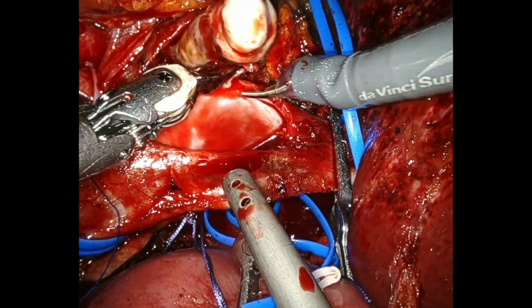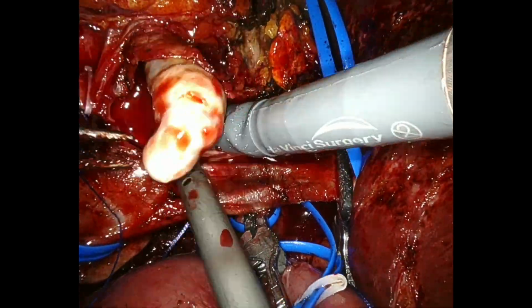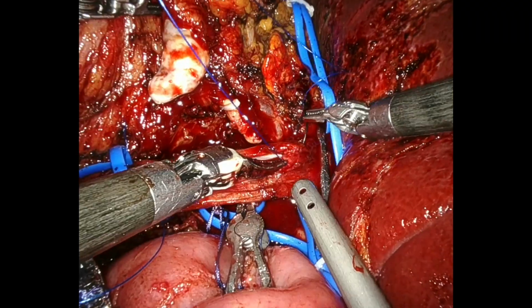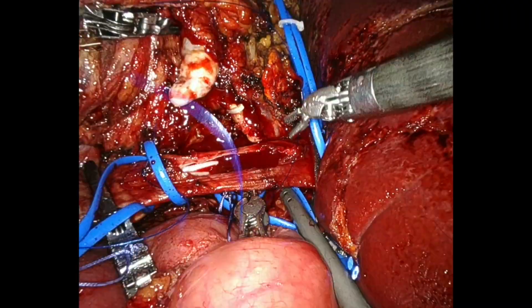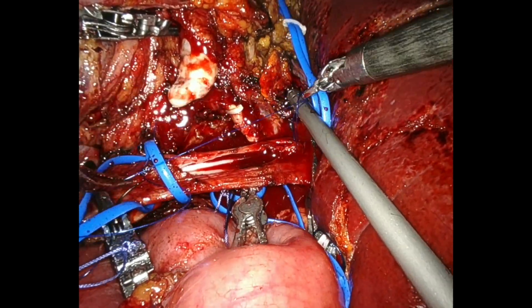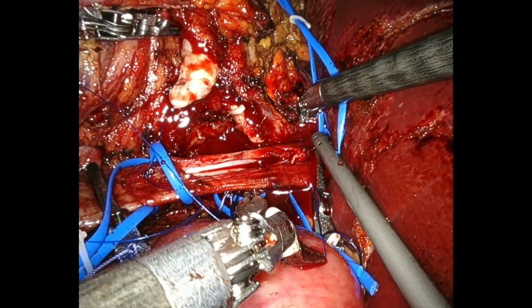The thrombus is thin, retractile, and highly indurated. Vena cava is then sutured using a 4-0 proline.